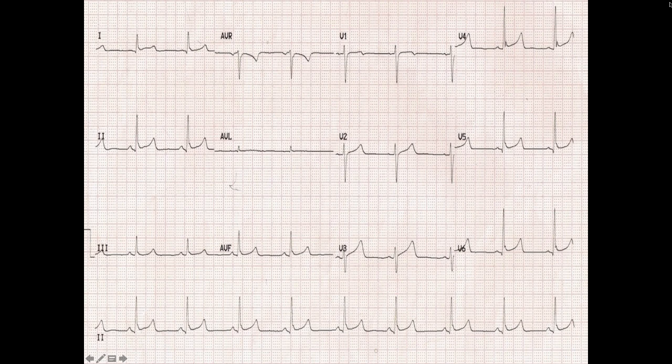So is my patient having a heart attack in every single region of his heart at the same time? Probably not. Especially if he is up and talking to me, asymptomatic, 23 years old, and otherwise healthy.